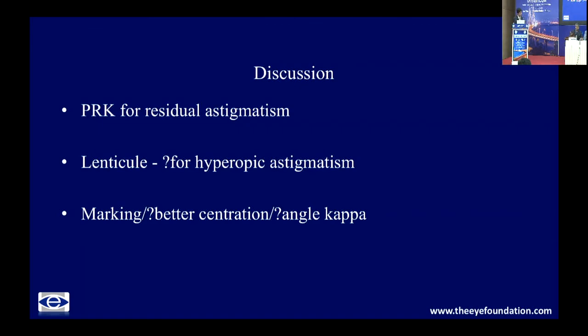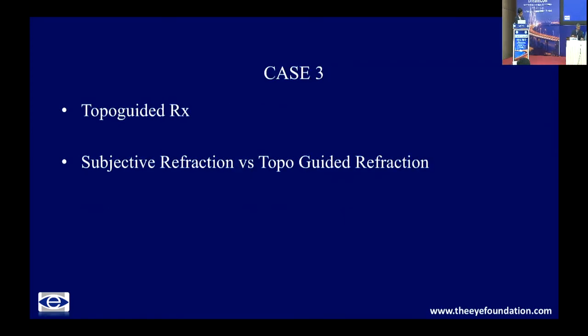One very important question, and then we have to go on to the next speaker, just for time. What is the lenticule thickness which you use for the correction? Like, how do you calculate? No, I used a myopic lenticule with a half a diopter additional. I didn't use 2 diopters, sir. Correct, but the back vertex? See, I do a cycloplegic refraction and use back vertex correction, distance, yes, and then it works well.